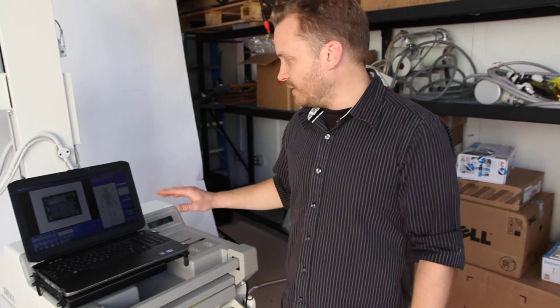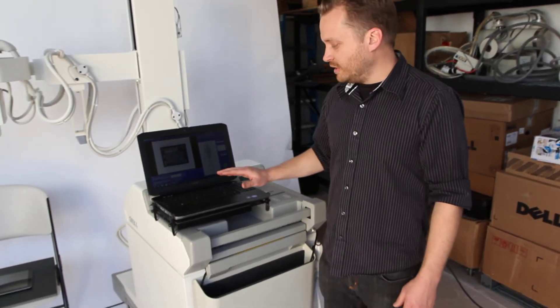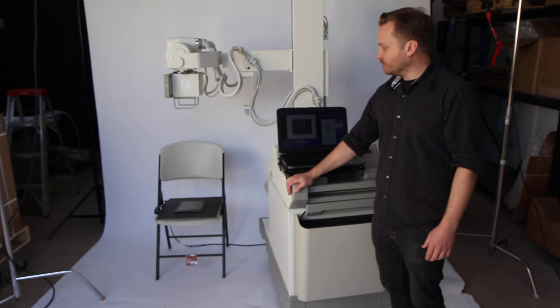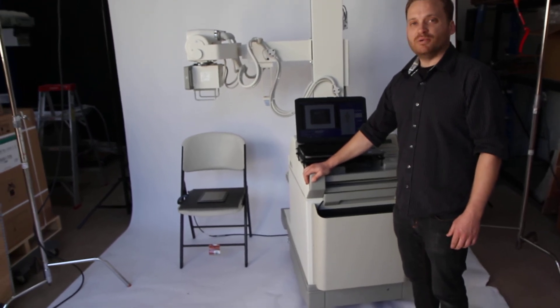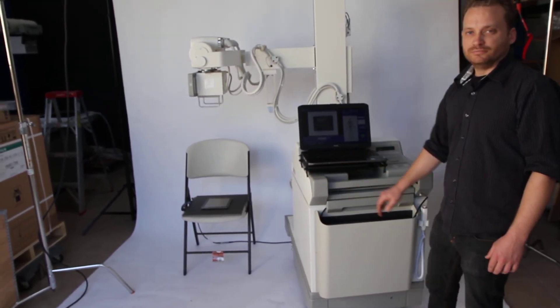Once again, this is the Dicom Solutions AMX retrofit kit for a mobile x-ray with the 14x17 tethered panel. Thank you.